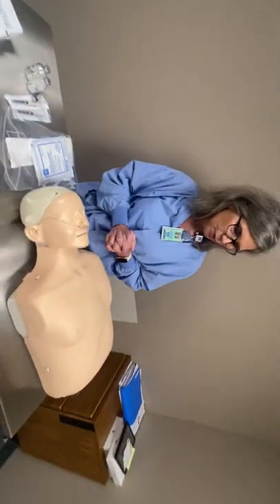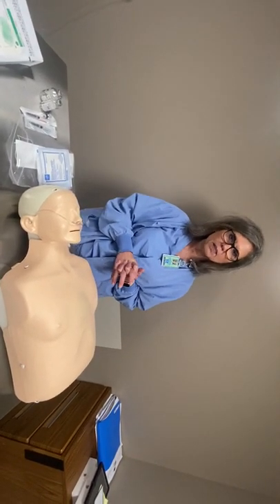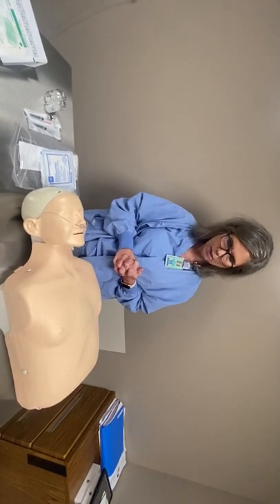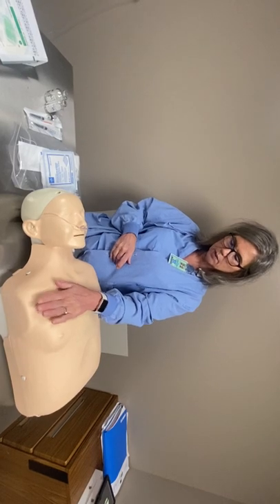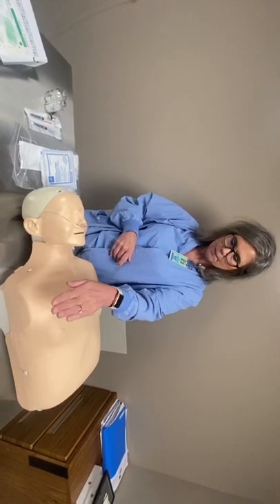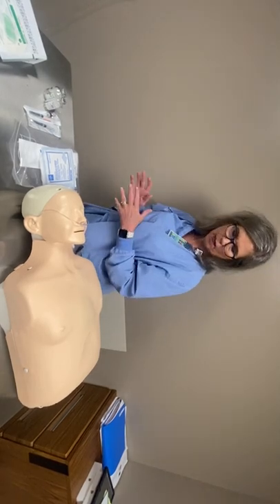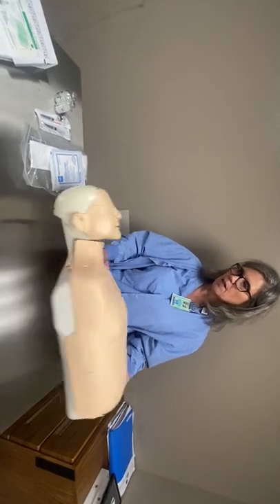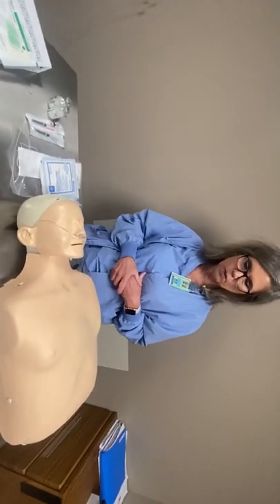Then you go into the room, tell the patient you're going to do the block, and ask the family to leave. The ultrasound will almost always be on the opposite side from where you're doing the block. We're going to be doing an interscalene nerve block on this side, so the ultrasound machine will be here, I will be here, and we'll have the rail down ready to go. Some of the doctors like the patient on their side, so if that's the case have that ready too. Consult the book.